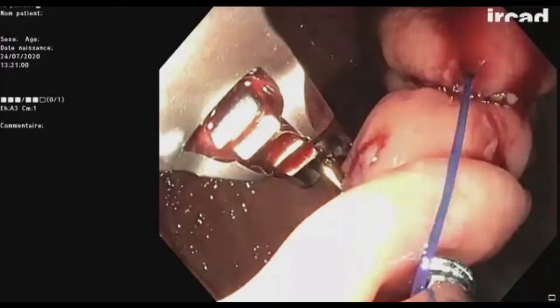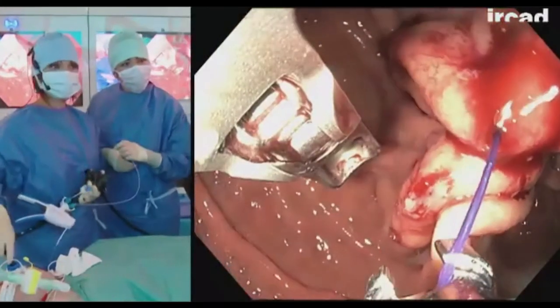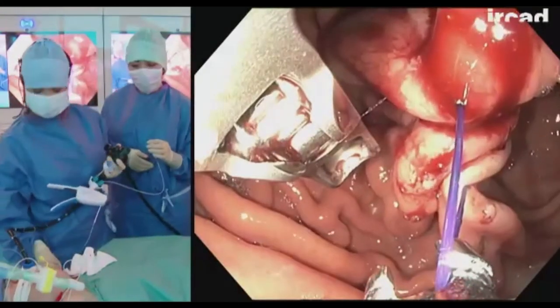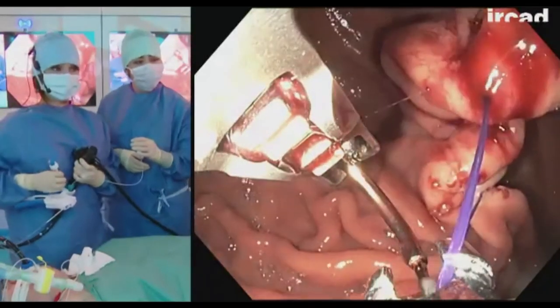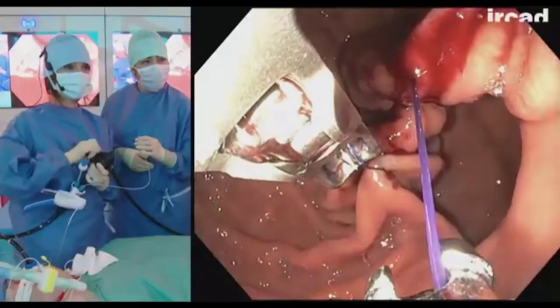She has a very strong peristalsis. That's why you have the impression that the incisura is moving away, but it's just peristalsis. So this can actually happen. If you're not sure about where the incisura is, you just look at the upper part of the anterior wall of the stomach, and you will always find it.